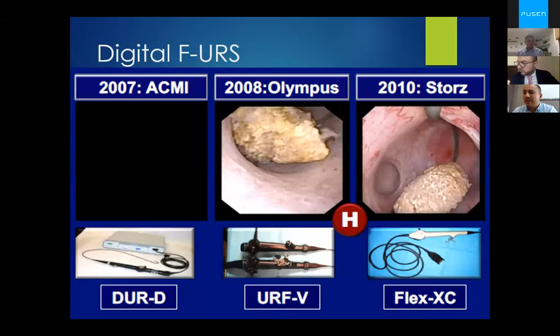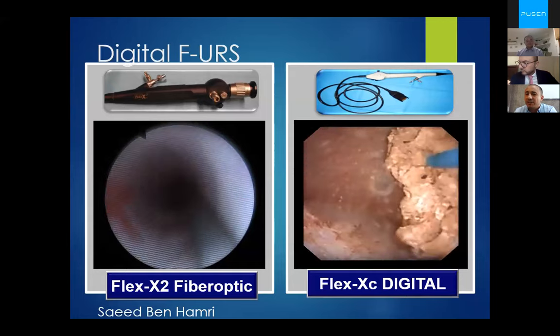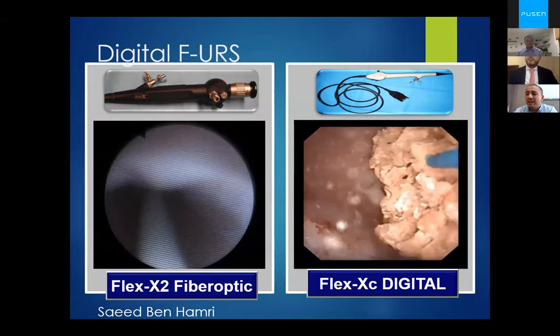Since 2007, the companies Gyrus ACMI and Olympus, and then Storz, have produced a digital flexible scope. Then multiple other companies produced their own digital scopes. This technological improvement has considerably improved the quality of the endoscopic image, like we see here, between Flex-X2 and Flex-XC from Storz, by eliminating the honeycomb effect.